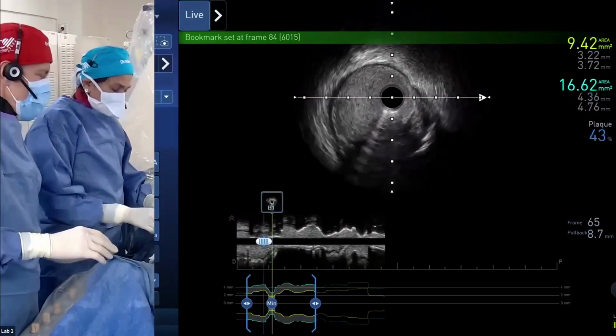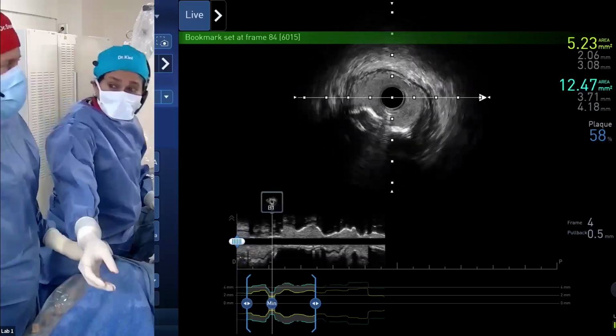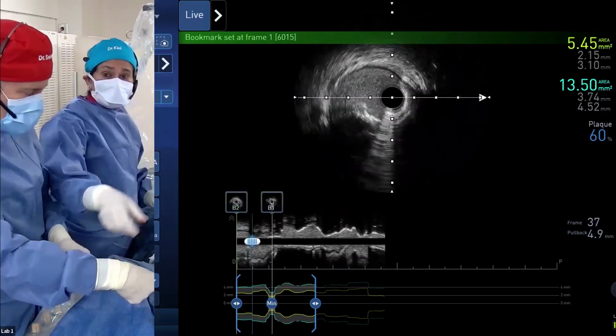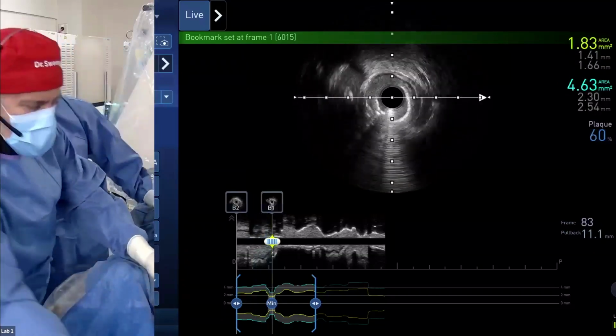I'd give me a 2.5 NC high pressure balloon first, and then a 2.5 cutting high pressure balloon, and then IVL. Don't open the cutter. 2.5, 15, high pressure. Rota. Now hold on. Dr. Sharma has arrived here.